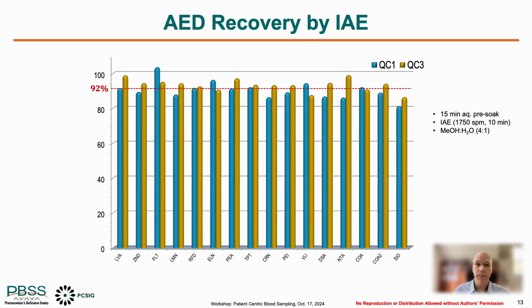Under optimized impact-assisted extraction conditions of 10 minutes at 1750 strokes per minute in 80% methanol, preceded by a brief aqueous pre-soak, we observe an average recovery for the 16 AEDs greater than 90%.